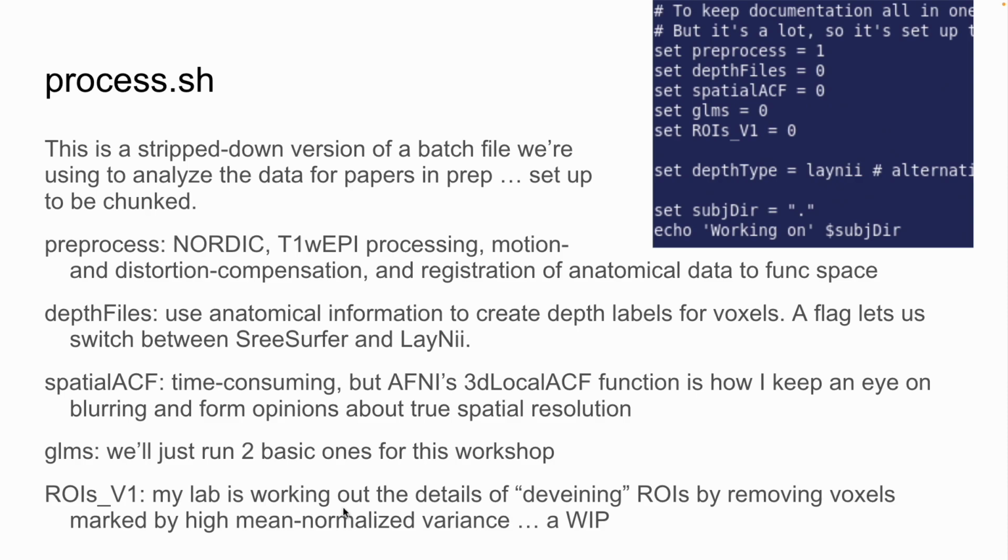An option, equal bins. That matches where you basically make sure that each layer has the same number of voxels, if that's what you want. Yes. You basically sort all the voxels based on the metric and chunk it into bins based on the number of voxels, not into bins of cortical depth that are normalized based on the depth estimate. It's not geometry, because equivolume conceptually would give you that answer. I felt like I must be doing something wrong if equivolume didn't naturally give me that answer.